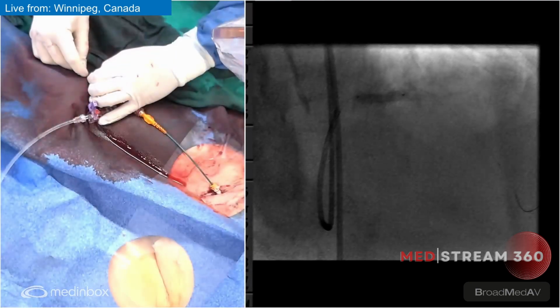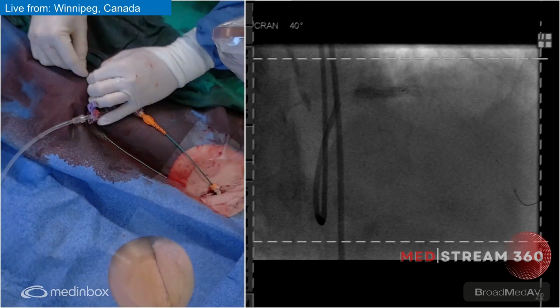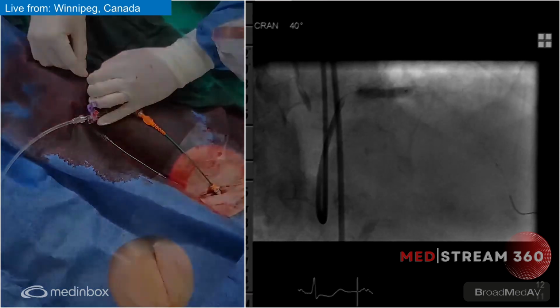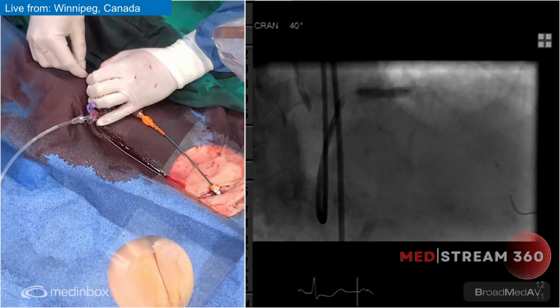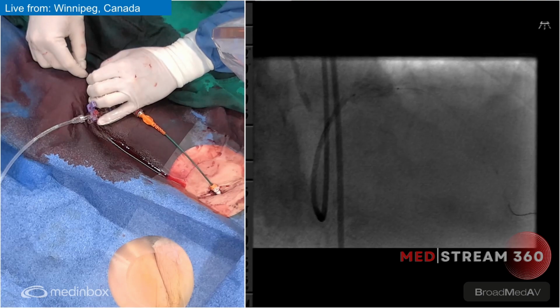A good shot of that with Cine potentially. Yes, okay, let's do a Cine here. I think it looks fairly good. Much better than it could have. And down. I think that 14 made a difference. Absolutely. Although I'm always apprehensive about using a large burr on nodules or large burrs.